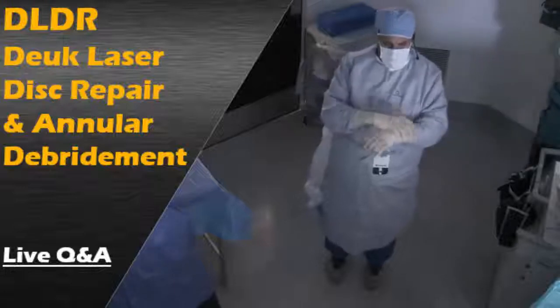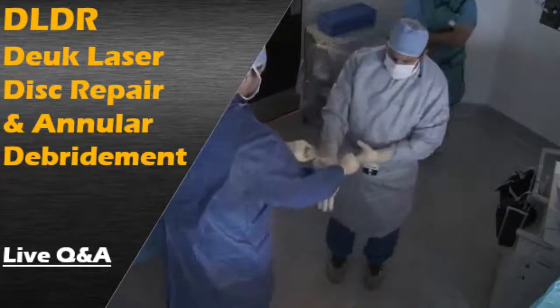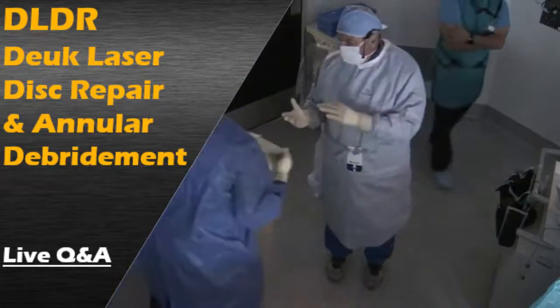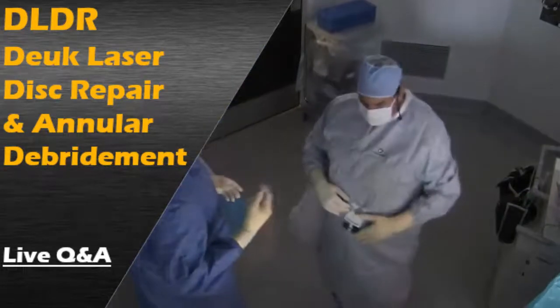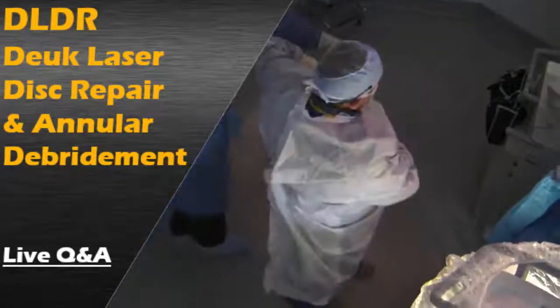Laser disc repair in the lumbar spine, which is the lower back, on a patient with 2 herniated discs, one at L4-5, the other at L5-S1. She has back pain and pain down into her right leg, intermittent symptoms in the right leg consistent with radiculopathy, which is a problem with the nerve root.